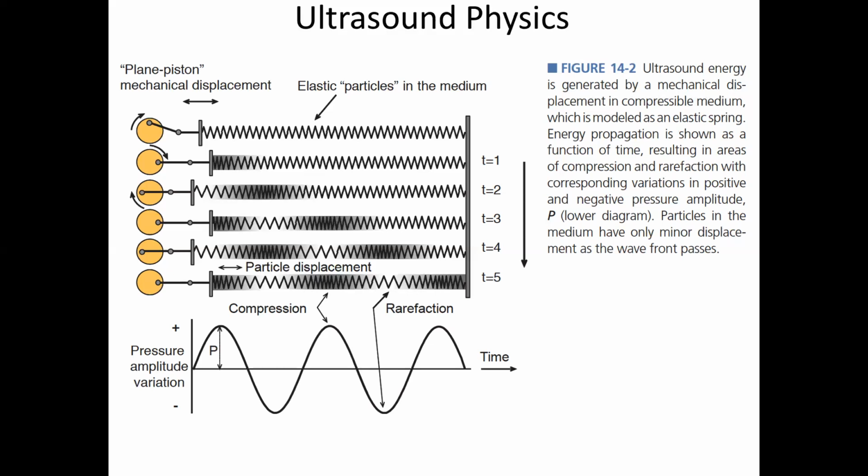But we're not going to think about that until the next lecture. Okay. So to first order modeling this, if I freeze time and look at my medium, I'm going to have a high pressure part, zero pressure, so I'm back at my equilibrium condition, and then a stretched part, right? High pressure, stretch, high pressure, stretch.